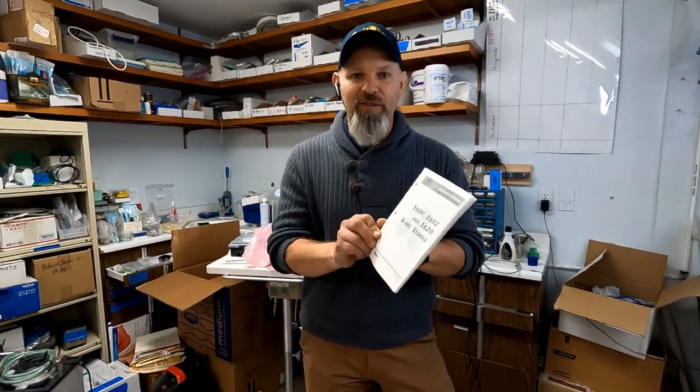So this video is something that I was really excited about today, and it's kind of strange because I love what I do, and this is just such a fun profession to be in. And we're sorting through a bunch of equipment, and I've been wanting to do this type of video for a while, but we were putting things away and I found this manual. This is for a dental stool, an ADEC dental stool manual. This is possibly the most boring piece of literature that you could ever find in a dental office, and it is just this little booklet.